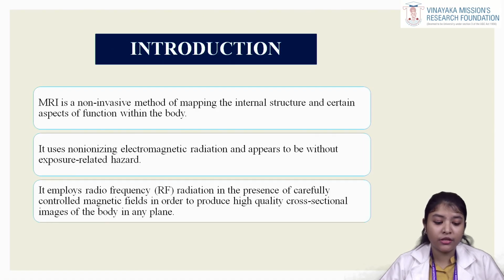MRI is used as a non-invasive method for mapping the internal structures and certain aspects of the functions within the body. It uses non-ionizing electromagnetic radiation and it does not cause any exposure-related hazards. It uses radio frequency radiation in the presence of an electromagnetic field that produces high-quality cross-sectional images of the body in any plane.